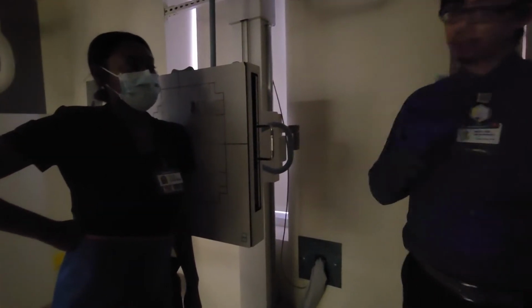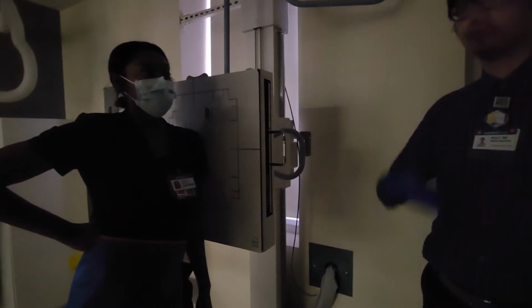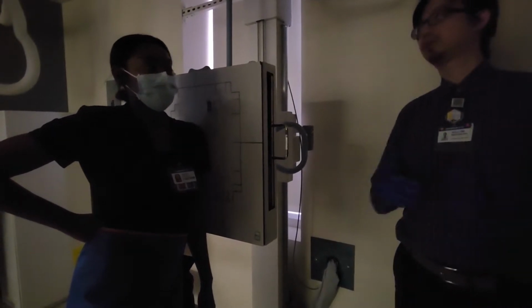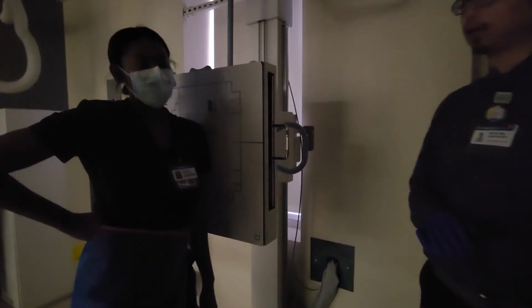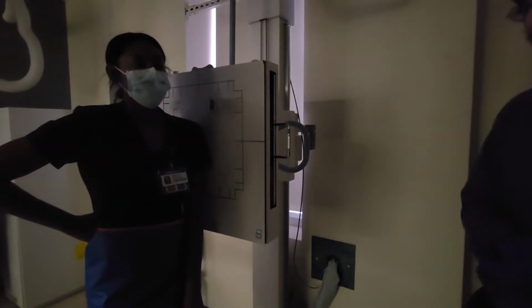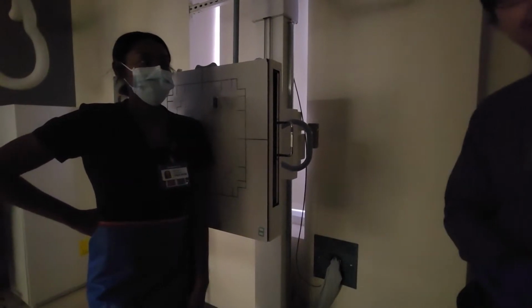But if I don't want to see that anatomy, right? Like I don't want to see the lungs. If the lungs are moving, it blurs the lungs and they kind of remove themselves from the image. And now I have a much more clear picture of the stuff through the lungs. In other words, I have a much more clear picture of this left arm.